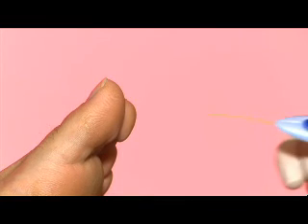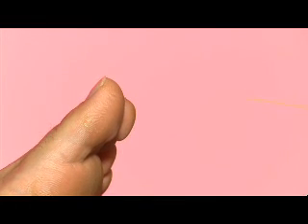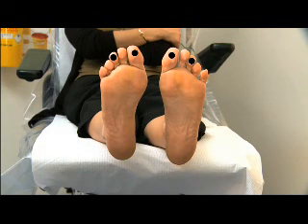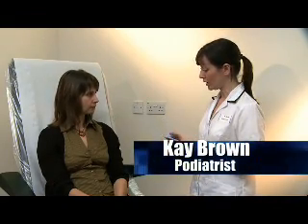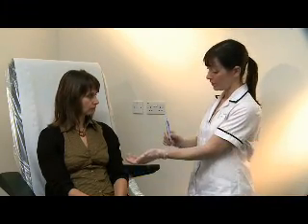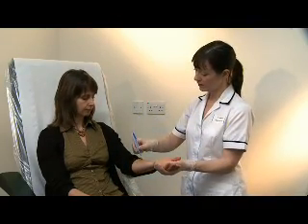We are now ready to carry out the neurological test using the monofilament. We test the 1st and 3rd toes and the 1st, 3rd and 5th metatarsal heads, recording as appropriate. I'm about to test the sensation in your feet using this monofilament, but first of all I'll test it on your arm so that you can see that it doesn't feel sharp. Okay? You feel that? Yes.